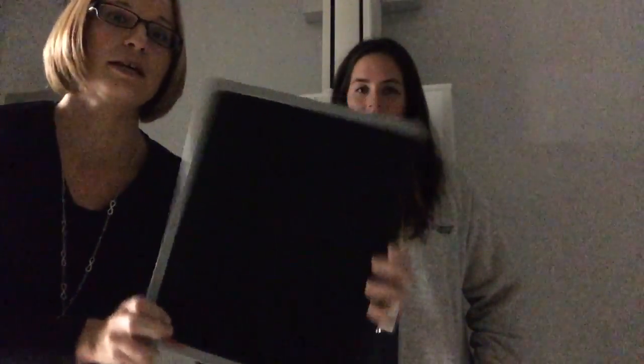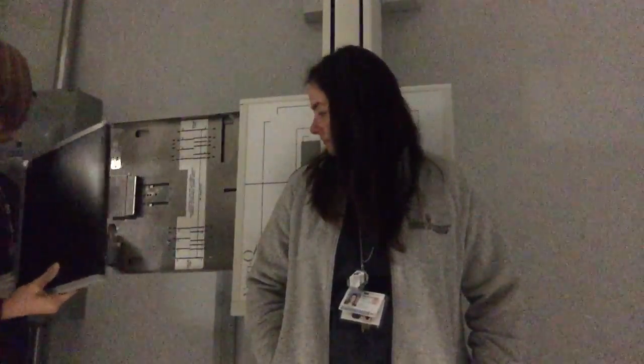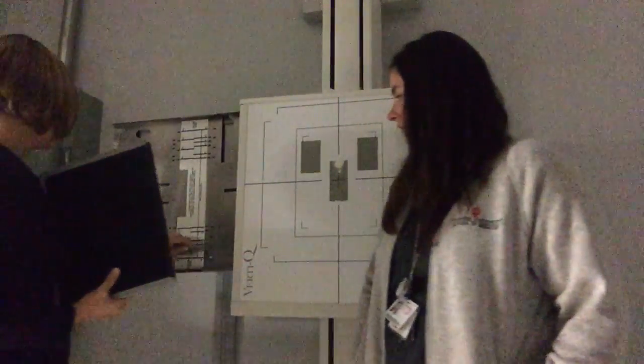We're going to do these standing up against the wall bucky. Your SID will be at 72 inches. You're going to use a 10 by 12 cassette and the red line is going to go at the bottom. Put it in the bucky using the little lever and you're going to put it right at the 10.